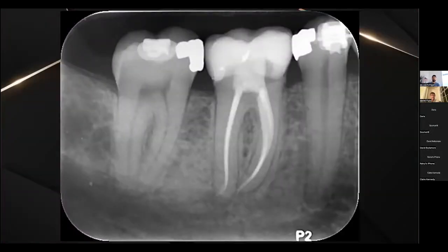And then that's the post-op here. So even though I have injected the sealer into the canal and coated the sealer and placed it all the way, it's not like we've got excessive extrusion. It doesn't mean that when injecting the sealer you're bound to get a lot of extrusion. And this is a tooth where the dentist, well, actually I think the prosthodontist, is now going to replace that crown.